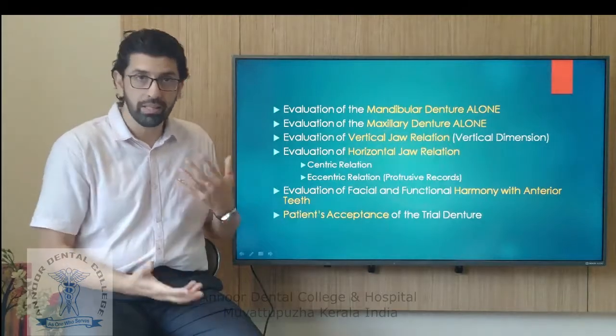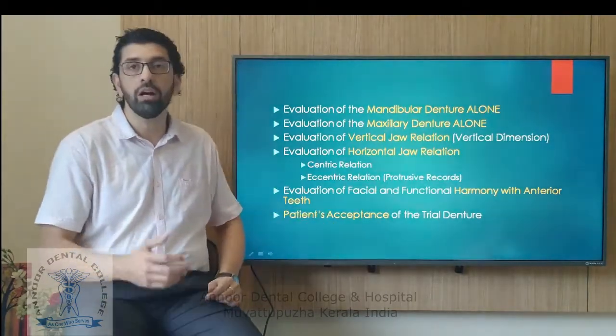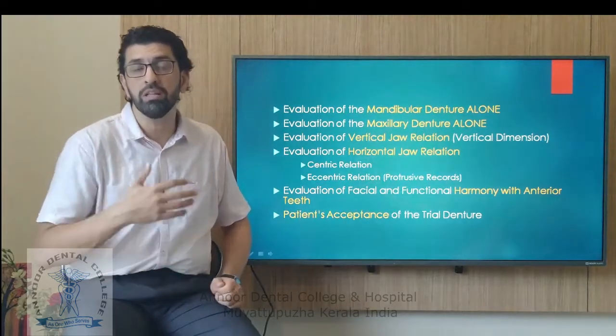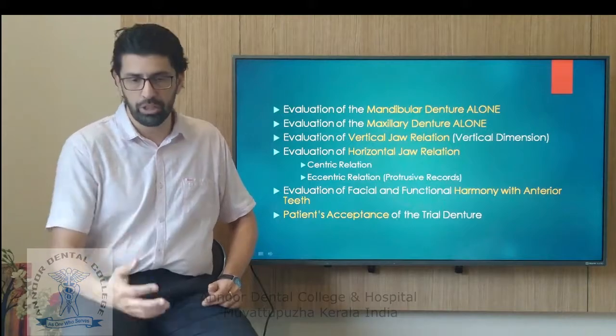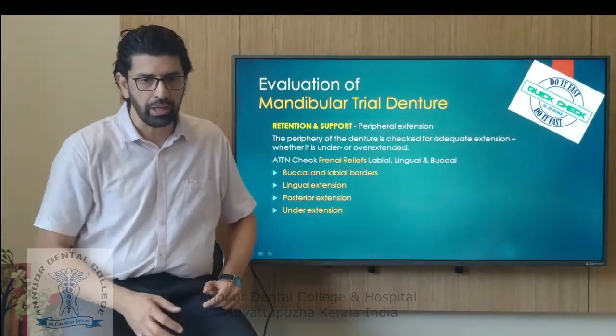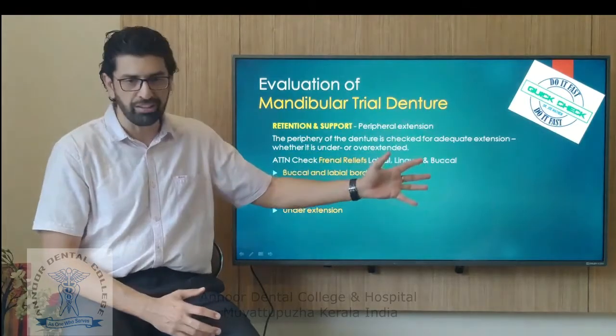Okay, so what's the aesthetic aspect of it? Is it functionally good? And finally, we're going to look at how the patient feels, and what are the considerations with regard to the patient's acceptance of this arrangement. Okay, so this is a quick step, right? I put up there, do it fast, quick check, all right?